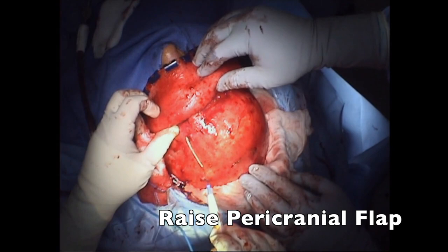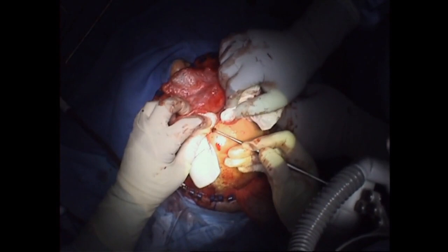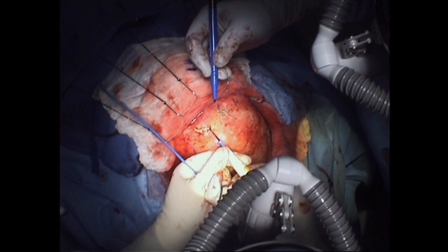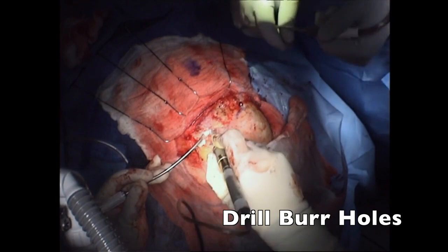After the skin has been raised, an incision is made in the pericranium to allow us to raise it anteriorly, pedicled on the supraorbital and supratrochlear vessels. The next step is to access the craniotomy just above the frontal sinus.